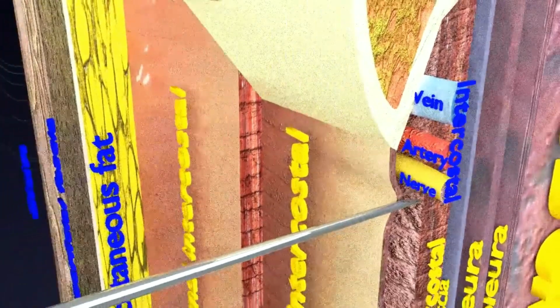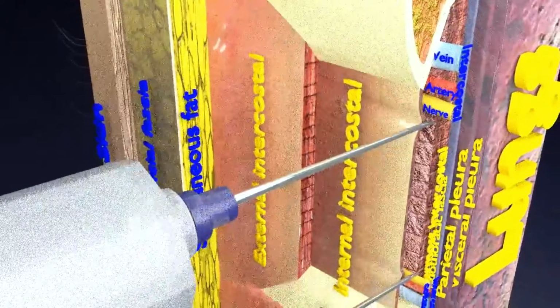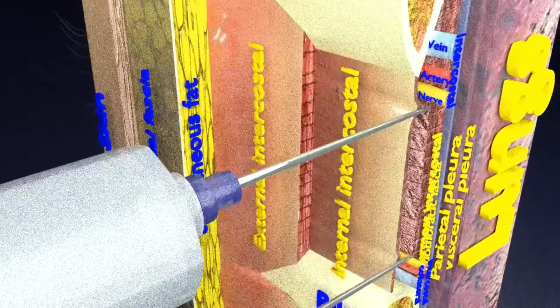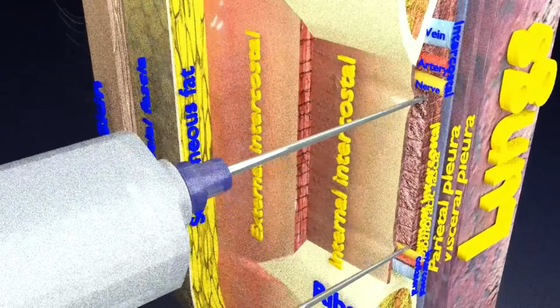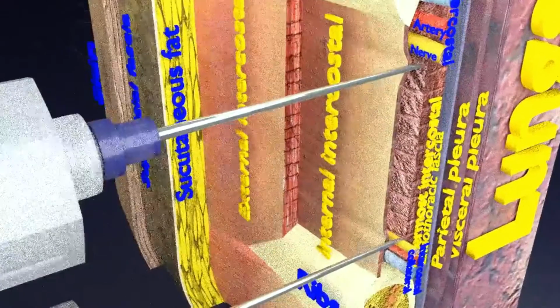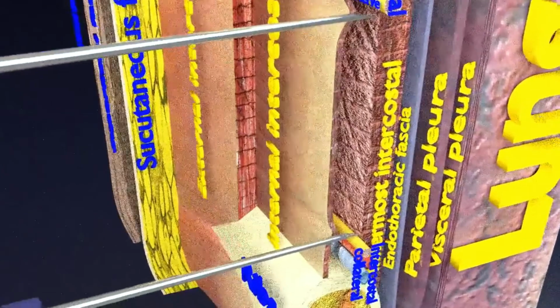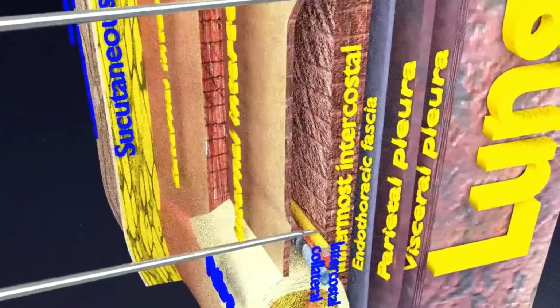The intercostal nerve block is generally performed transcutaneously at the level of the posterior axillary line. The needle is inserted until bone contact with the rib is obtained. It is then partially withdrawn, reoriented caudally, and advanced less than 0.5 cm deeper than the bone contact. The use of a stimulating needle connected to a peripheral nerve stimulator may be helpful. Eliciting intercostal muscle contractions indicates adequate needle location.